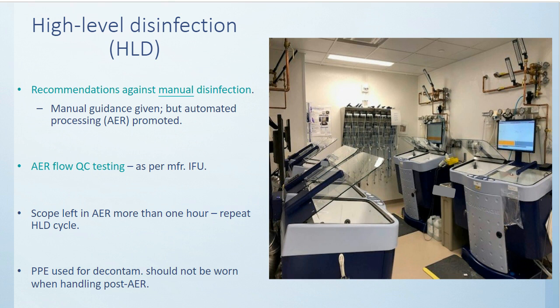There's direction that scopes left in AERs for more than an hour should undergo repeat HLD cycles. Again, we pointed out that biofilm only takes minutes to develop. The AER is a moist environment, and so scopes should not be left overnight for sure, but even more than an hour inside an AER without going through a repeat HLD cycle.